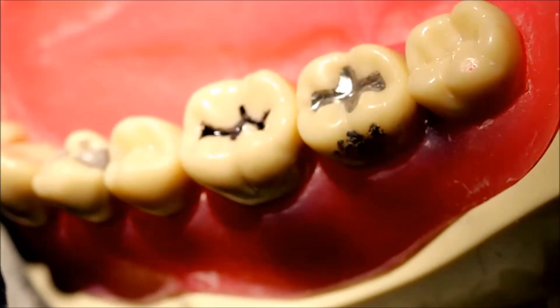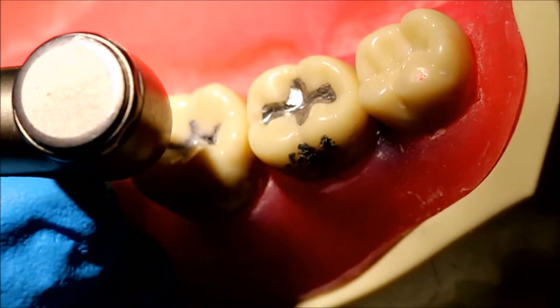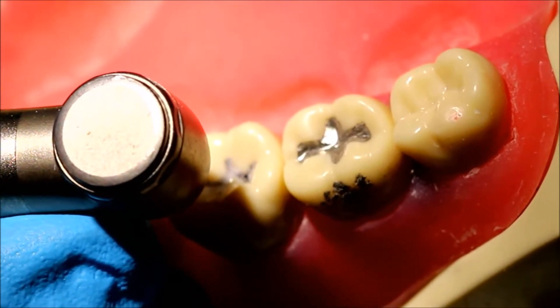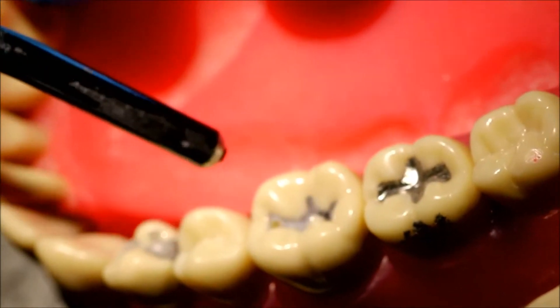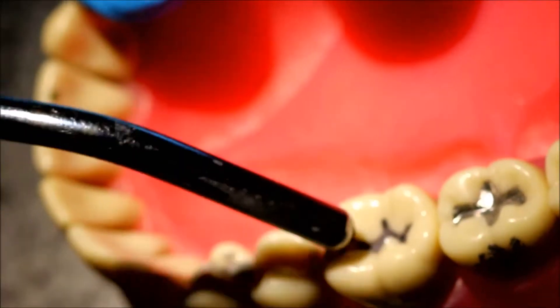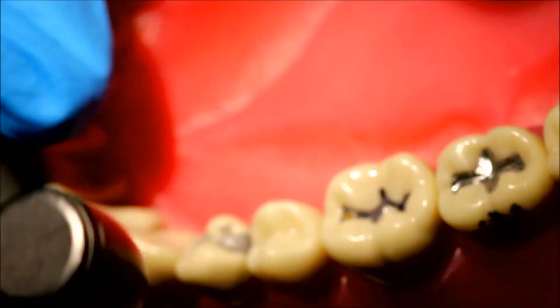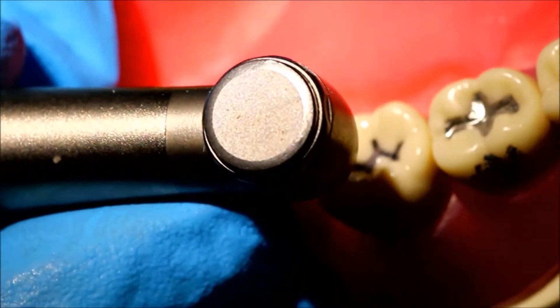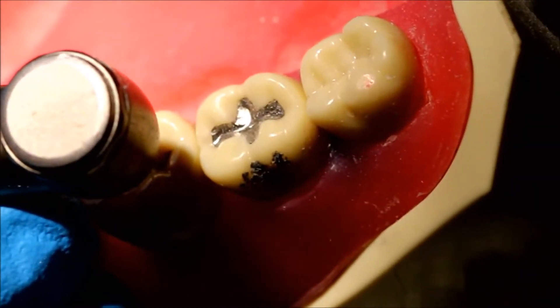As you can see, we have our outline form already drawn in with sharpie. The first thing to do is to cut to depth with your 329 or 330 burr by going up and down until you reach the entire depth of your burr. I like to start this at the dovetail, then extend your isthmus all the way through the central groove.